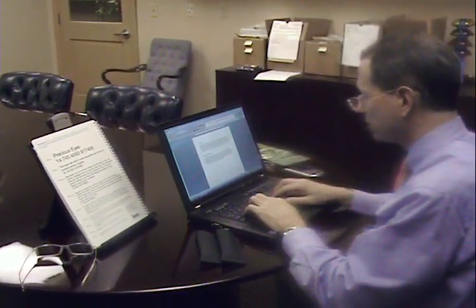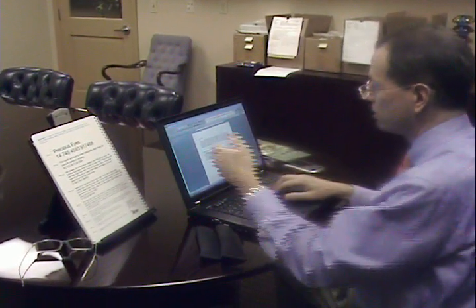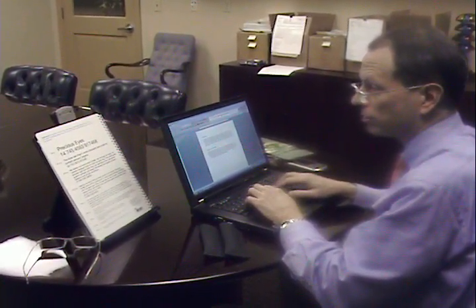If I'm going to be looking at my keyboard, I'm going to look through the lowest segment of the lens. To look at the computer monitor, I'm going to look through the center part. And to look further away, I'm going to look through the top portion. This makes it very comfortable to use.